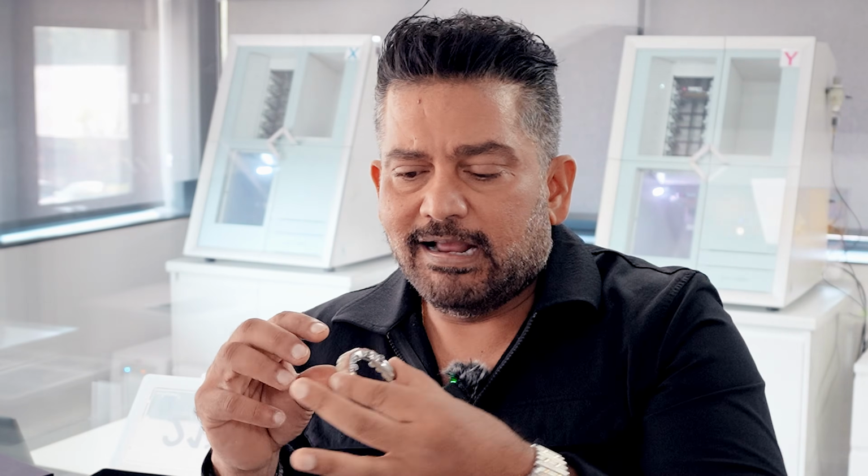It's instant. Then after that, at the end, we will fit your LTP, which stands for long-term prostheses. Again, we don't call them finals for a reason. It is a long-term medical device, and we make ours out of titanium and PMMA. And as you can see, the fitting side, the bit that fits against the gum area, is a very highly polished metal. This is the most hygienic surface you can put against gum tissue. Nothing is more hygienic than that.